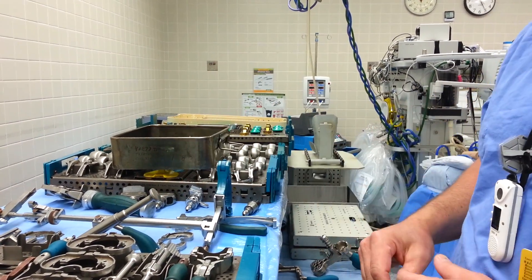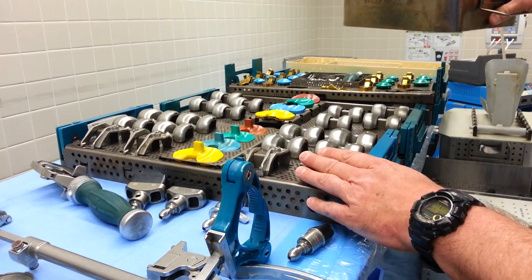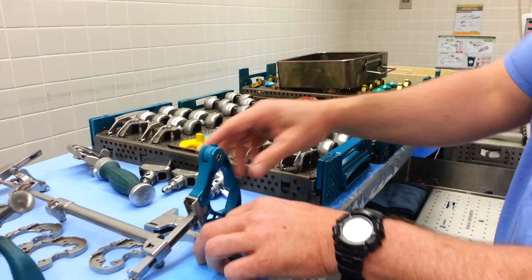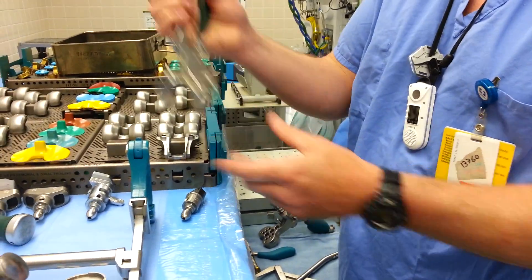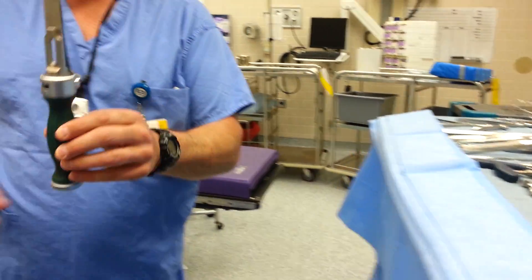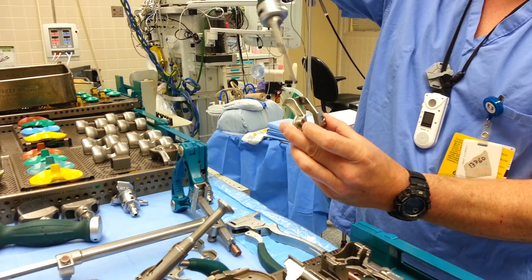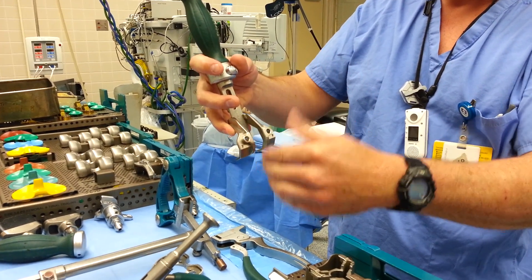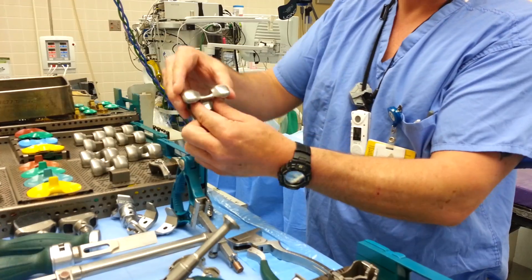Now you know your size is a four. You can move on to a four box if you're going to do posterior stabilized, or move on to your tibia if you're doing cruciate retaining, which has no box. For the box, you need a handle and a size four box. They will pin this on the femur and then use a chisel. When this is on the patient with pins holding it in place, they will hammer the chisel down until it hits the stop automatically in the back, then saw this notch out. You've now created a notch for the box to stabilize the joint.